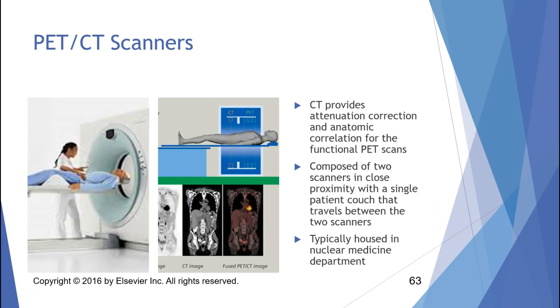In addition to having a CT scanner, which is right here in the front, you can see on this picture, right there in the aperture, this black ring, that is the clear sleeve that the photons go through for your patient. So your X-ray tube is housed right here in this green ring and your detector array. But what you don't see in this picture is that the gantry keeps going for about 5 feet.